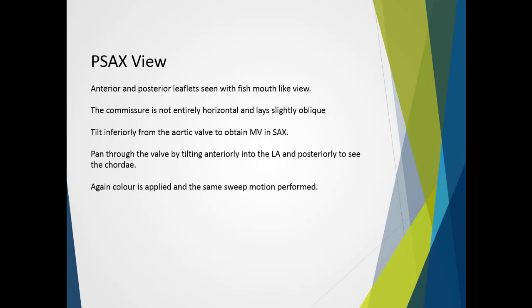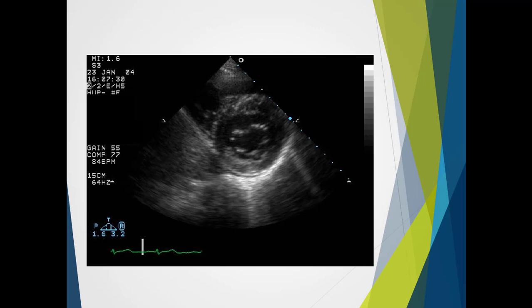The parasternal short axis view shows the anterior and posterior leaflets with a fish mouth-like appearance in diastole. The commissure is not entirely horizontal and lies slightly oblique, at around the 2 o'clock and 8 o'clock positions. This view is best obtained by getting the aortic view in the parasternal short axis window and then tilting down and inferiorly. The sonographer must pan through the valve by tilting anteriorly into the left atrium and posteriorly down to see the chordae. Colour is applied with the same sweeping motion. Here we can see the commissure line is slightly oblique, with the anterior and posterior leaflets visible.